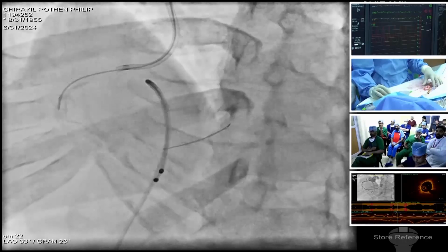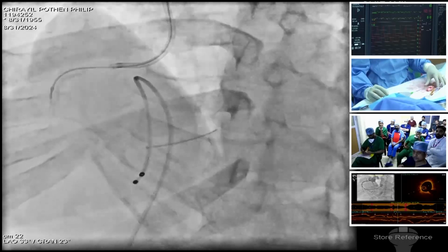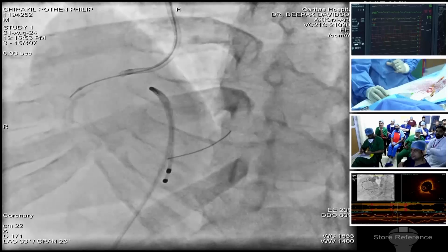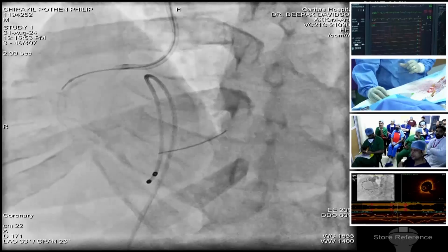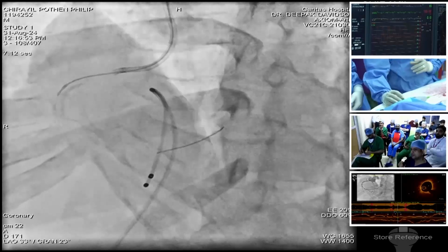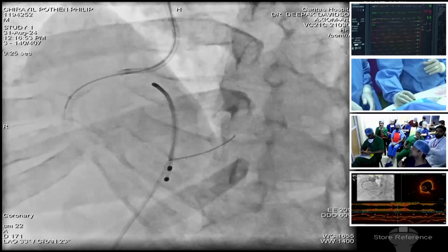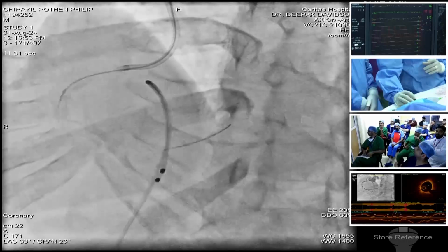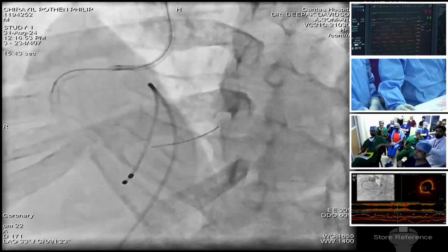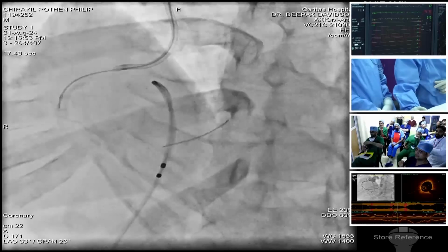Did you hear the pitch change? With 120, you can appreciate more. Compared to 80, the pitch change was more seen. Large orbit. So which means that certainly it has touched the calcium. True. So unless and until you hear some pitch change, you're not sure, it's just flying in and coming out, swimming in and coming out. It doesn't really do anything good for the lesion. But here at least we heard at this point of time there was some pitch change. Yes, yes.